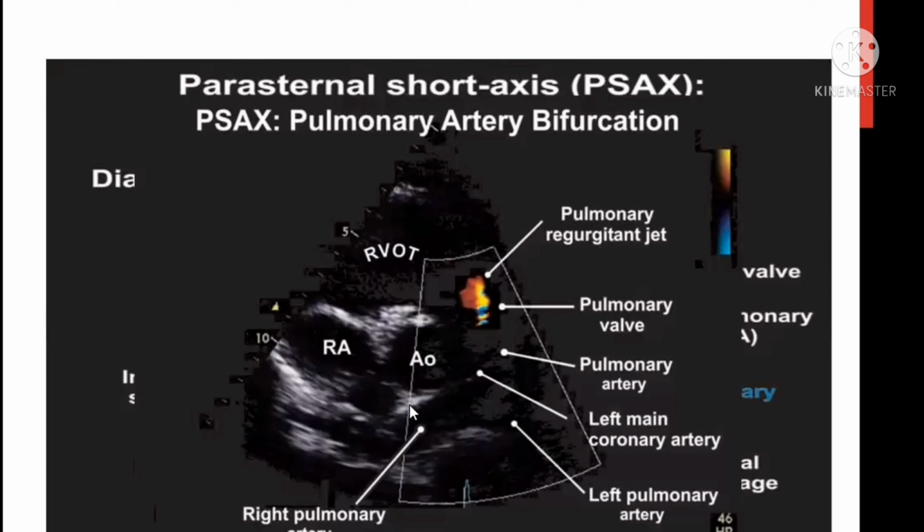So let's start from the pulmonary level. Okay, pulmonary level. This is what you see in the echo. It's a little bit difficult to see the pulmonary level because it's higher up. So you need to go higher up like this. Your probe should move like this. You should start from the aortic level because it's easy to find the aorta, because it's clearly defined by the Mercedes-Benz sign.